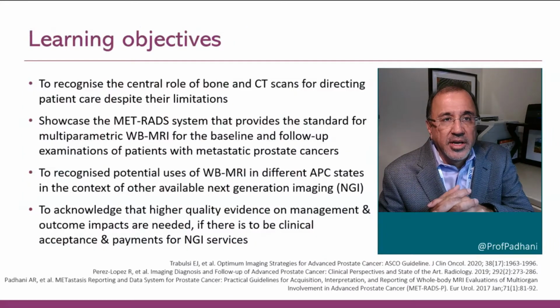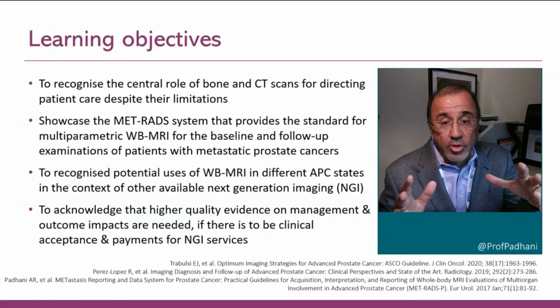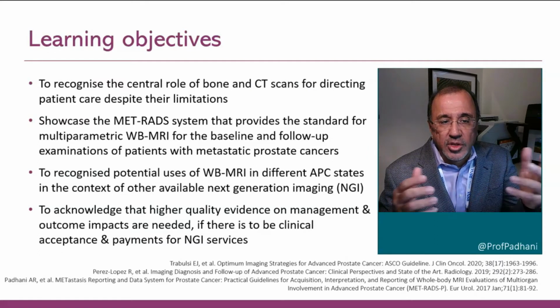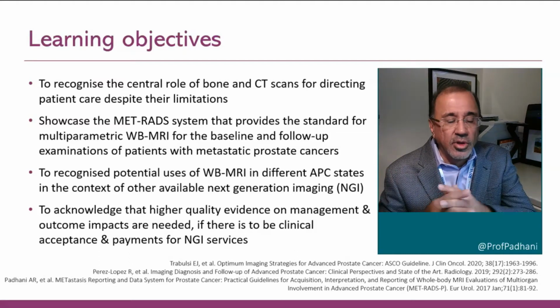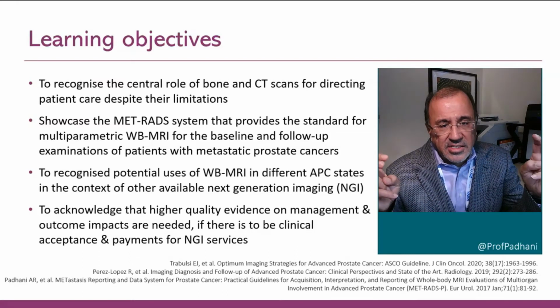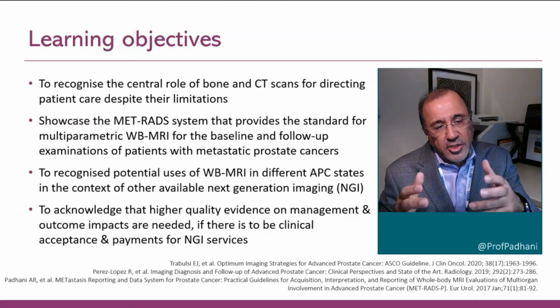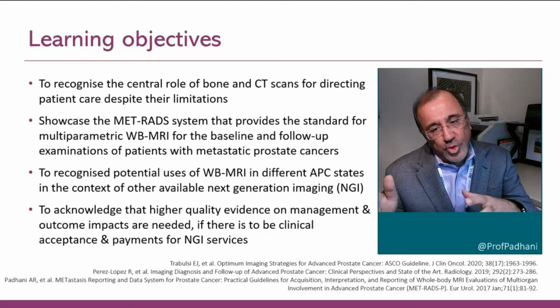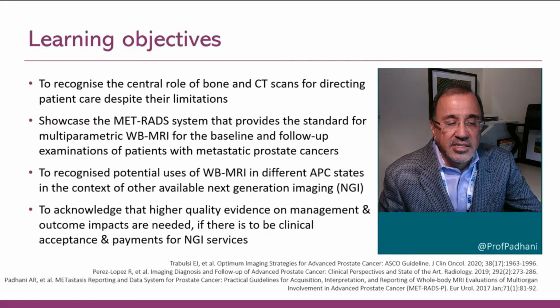We will start off by talking about the central role that conventional imaging plays in directing the care of patients with prostate cancer, despite its known limitations. We will quickly move on to the MET-RADS system, which is a multiparametric whole body MRI system that has been designed for the use of patients with prostate cancer.